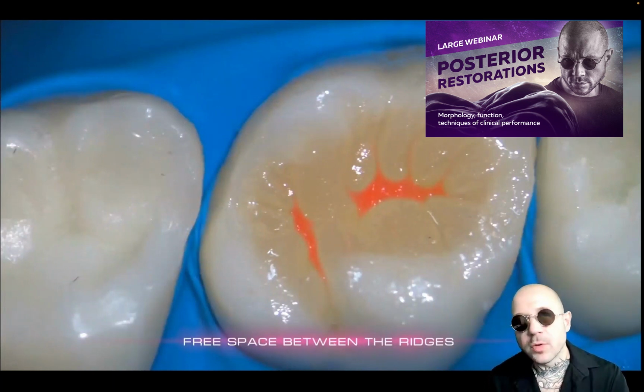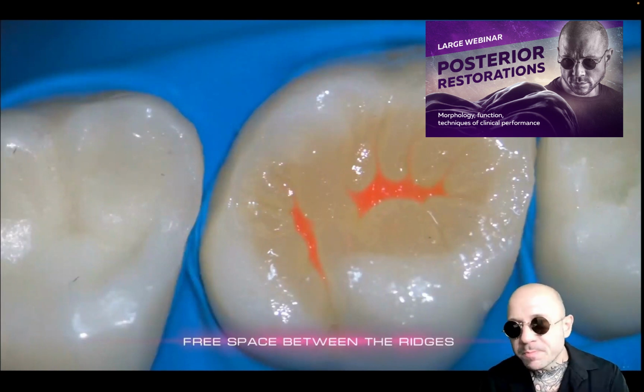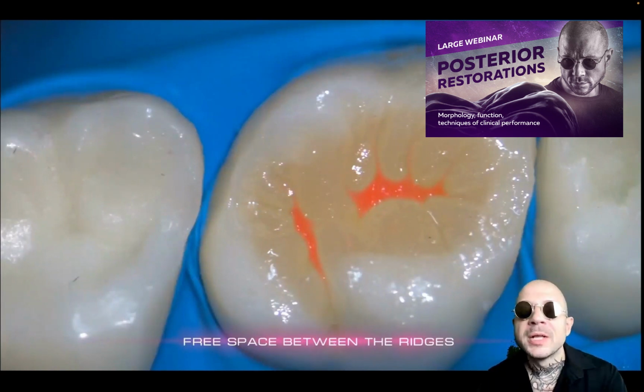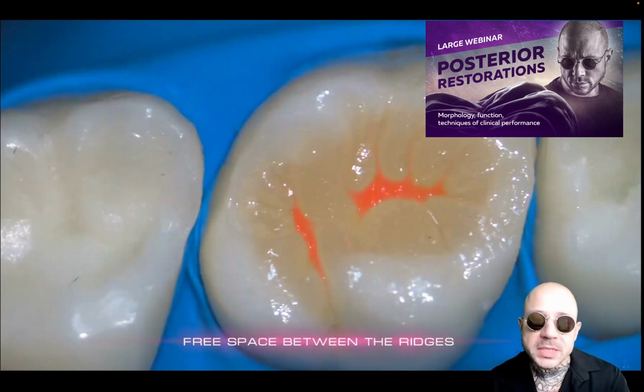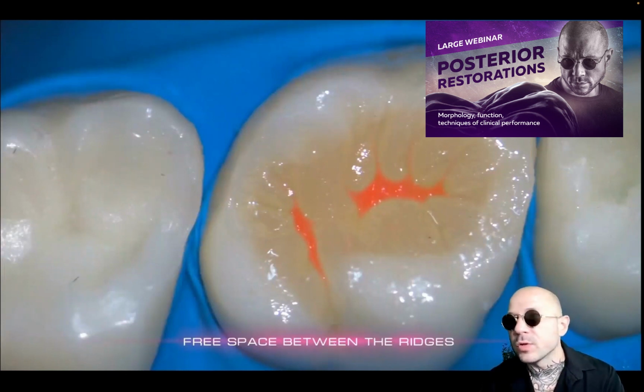If you made some mistakes on the way of modeling, on the way of shaping, the only possible option to solve the mistake is probably to cut the anatomical elements out and start from the beginning. It's not very convenient, because then you will have to implement an adhesive preparation once again.